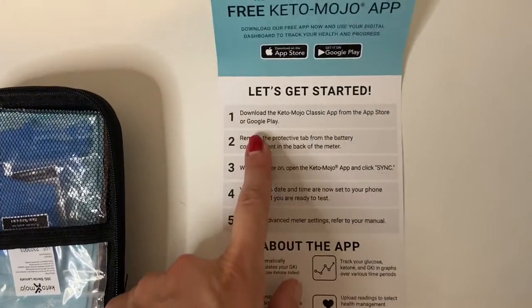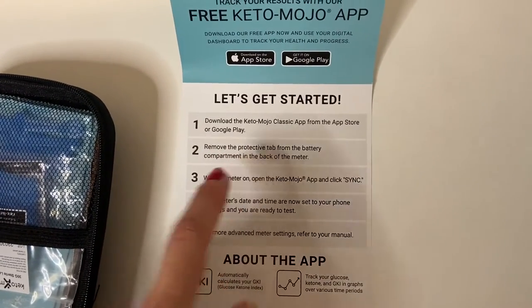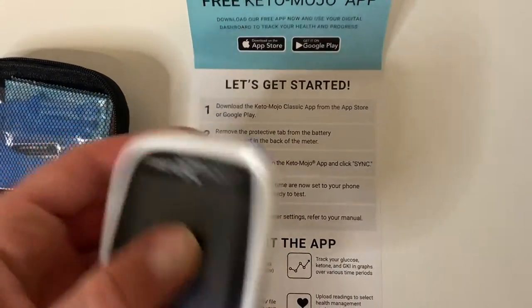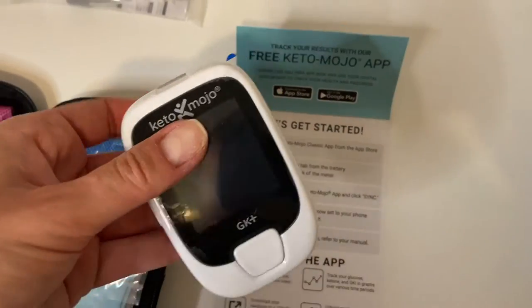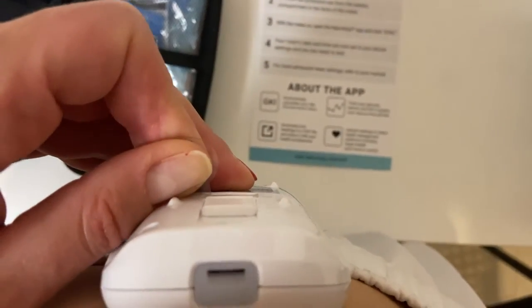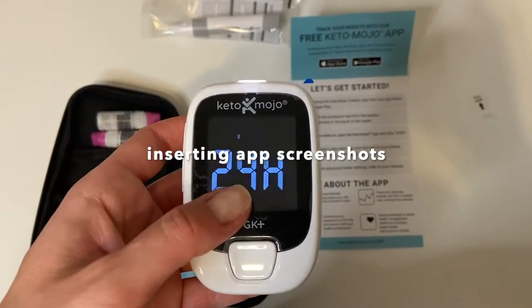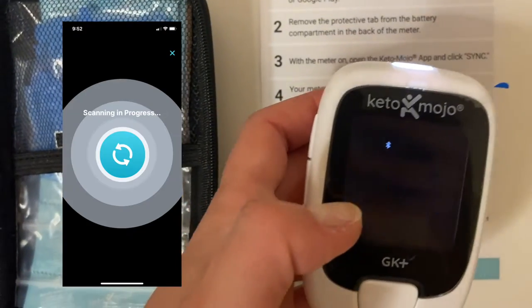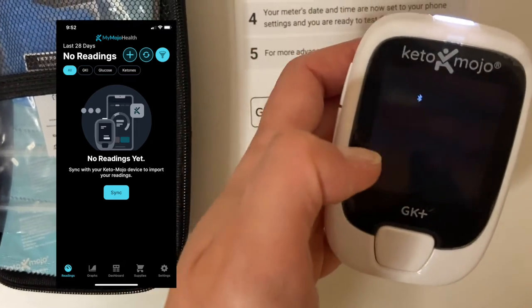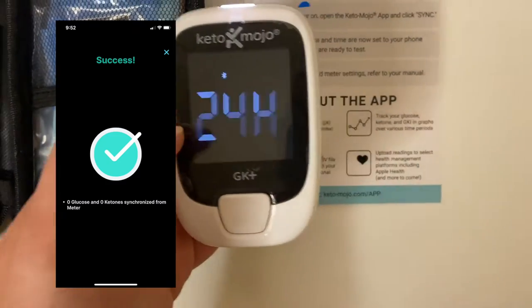Okay, I lied — I am reading the instructions. It's saying to download the app, and then it's saying to remove the protective tab from the battery, which would be this. Then we're going to sync it with our app. I just pulled out the battery tab and it's doing the beeping noise. With the meter on, open the Keto Mojo app and click sync. Your meter's date and time are now set to your phone settings and you are ready to test. Amazing!